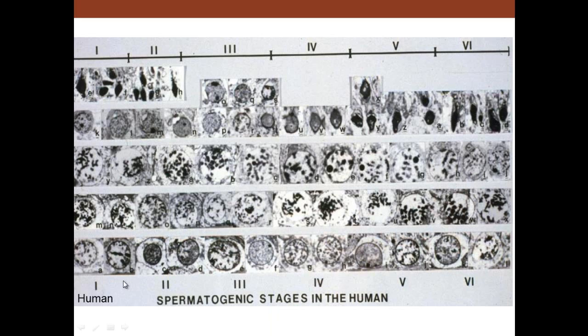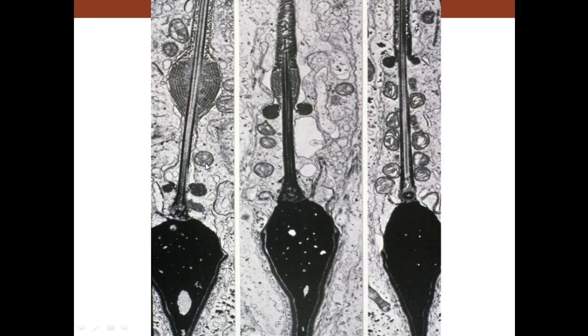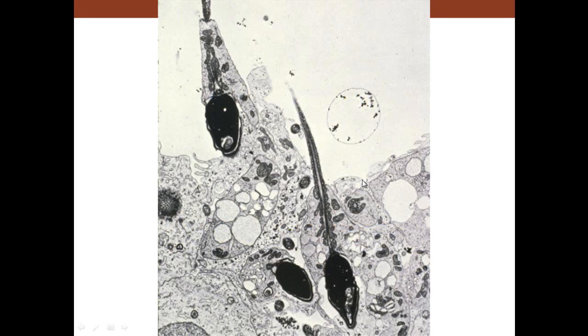And so here we see the whole scheme of things: spermatogonia, spermatocytes developing. Finally, you get secondary spermatocytes, and then spermiogenesis occurs. So we've got spermatocytogenesis, we've got meiosis, and then we've got spermiogenesis and development of sperm. The last phase is, as I mentioned, whenever the annulus moves down, as you see it's moved down here, then all of a sudden mitochondria can move in around the tail, and that's what occurs.